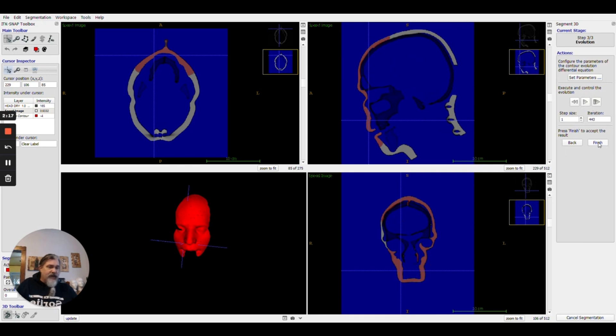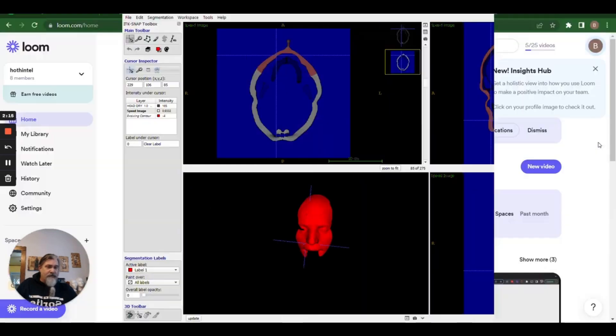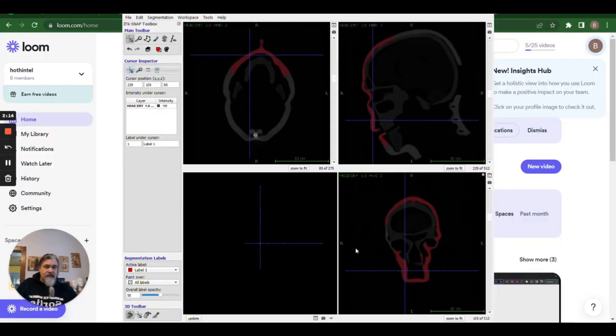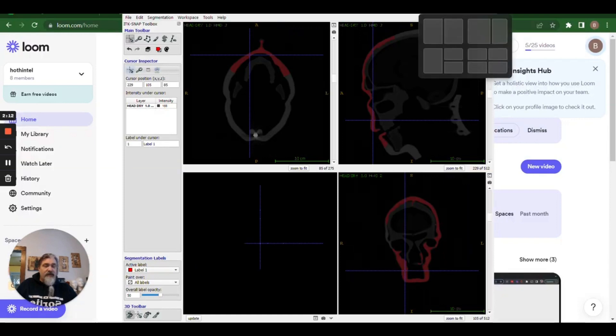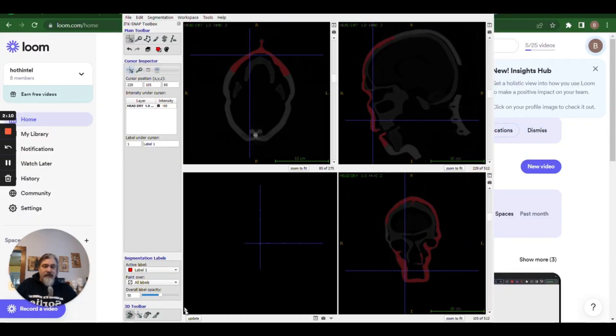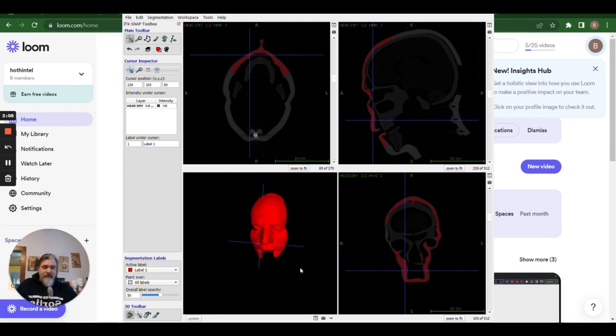it will now have created the 3D model. All right. We will stop there and cover how to export this next.